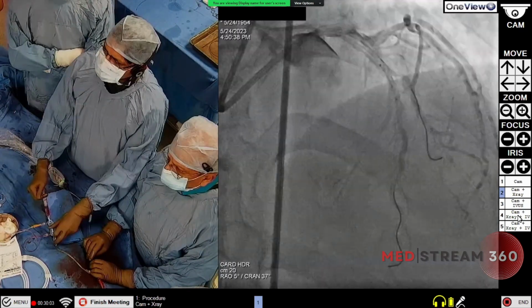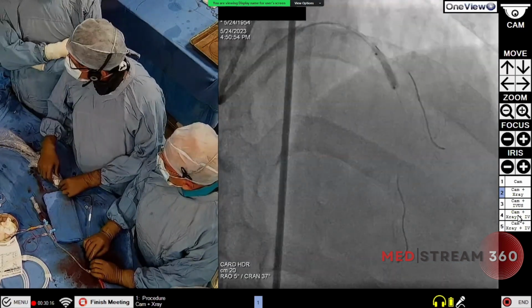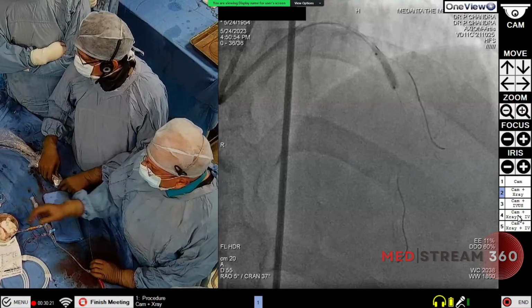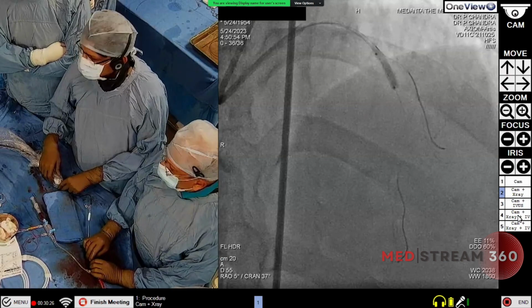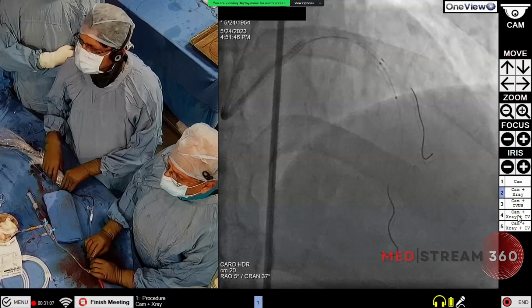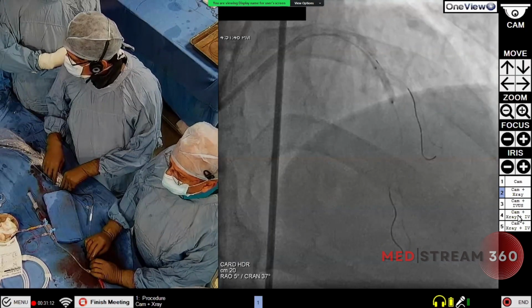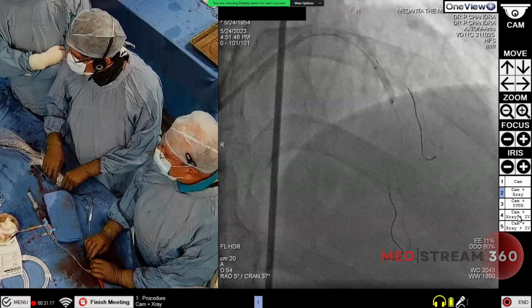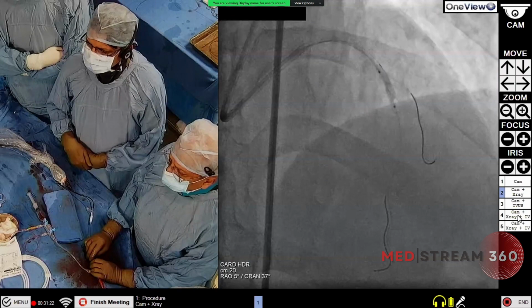So, okay. Go up. 1, 2, 3, 4. Starting pulses 29, 28, 27, 26, 25, 24, 23, 22, 21, 20. Stop. Okay. Go up, please. 19, 18, 17, 16, 15, 14, 13, 12, 11. Stop. Deflate.